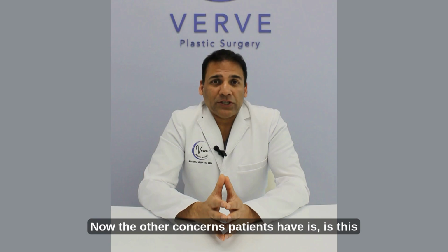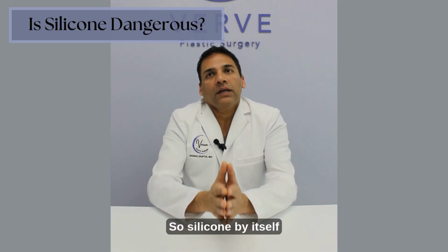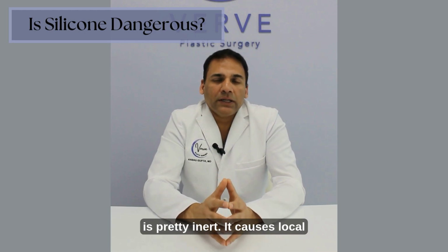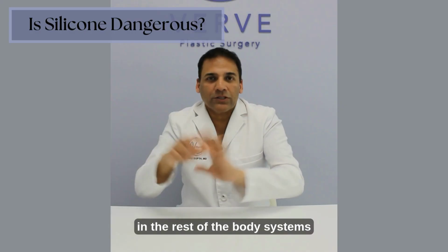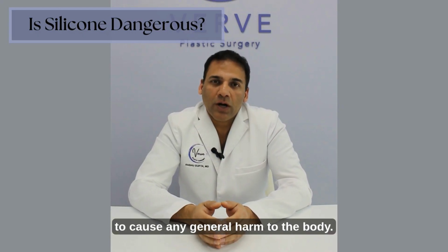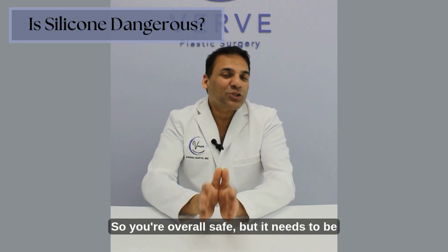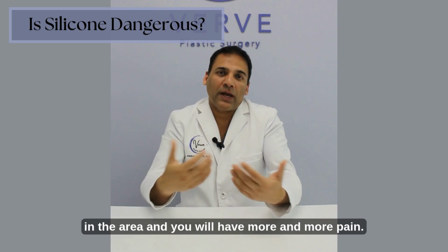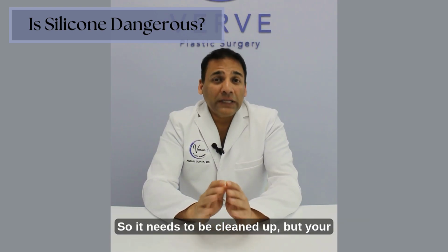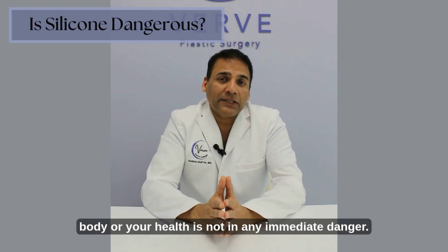Now, the other concern patients have is whether this silicone is dangerous for their body. So silicone by itself is pretty inert. It causes local inflammation, but it does not go into the rest of the body systems to cause any general harm to the body. So you're overall safe, but it needs to be cleaned up, because otherwise it will keep causing inflammation in the area and you will have more and more pain. So it needs to be cleaned up, but your body or your health is not in any immediate danger.